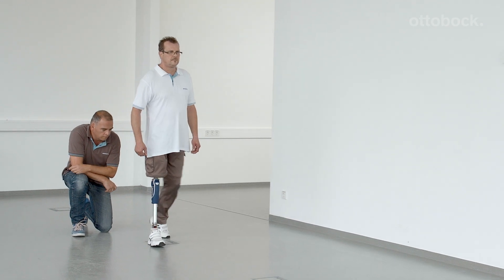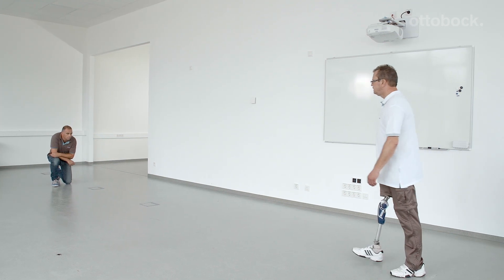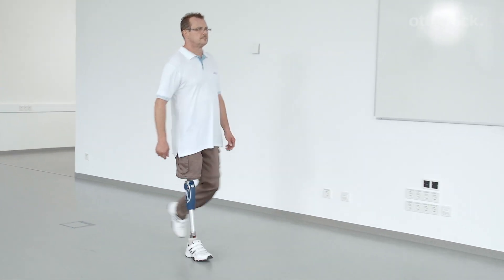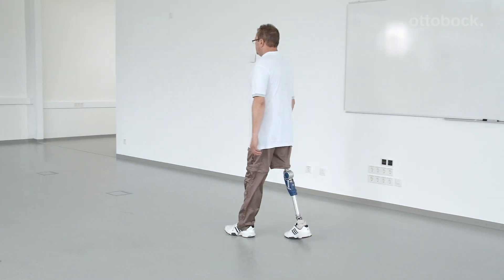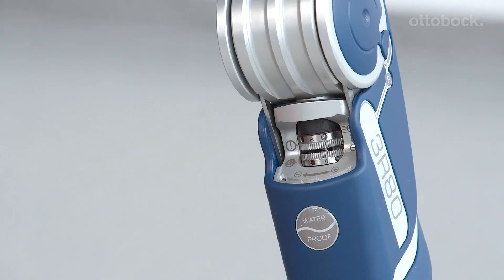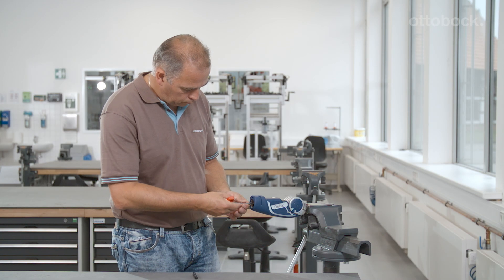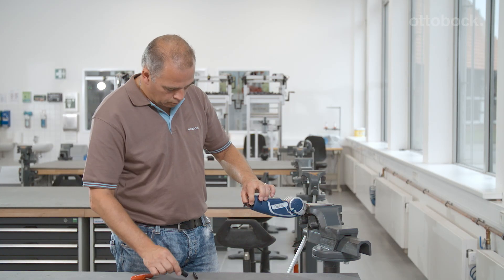At this point, all adjustments have been made and the user should be walking comfortably. Lastly, please put the black protective cap back on the knee joint to prevent dust from entering the joint and the adjustment rings from slipping. There is an additional compression spring included with delivery that can be used if the user needs more support in order to bring the prosthetic knee joint to full extension.